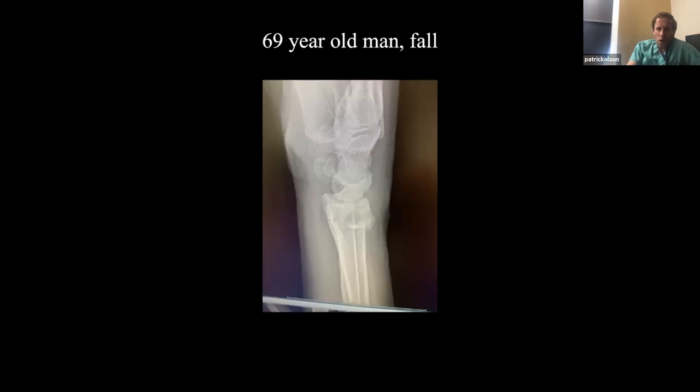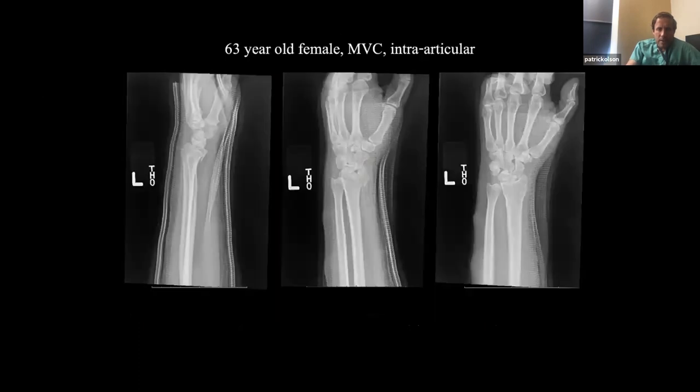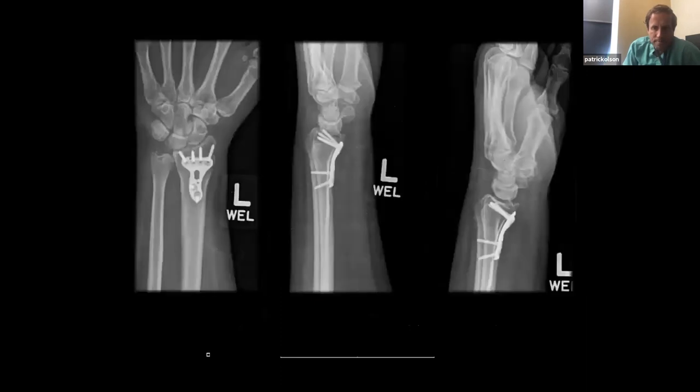Here are a couple of examples. A 69-year-old gentleman had a fall with a dorsally angulated distal radius fracture — this is the post-op. A 63-year-old woman had an intra-articular distal radius fracture — you can see the fragment — this is her post-op. I typically just do two proximal screws. There's a feeling you have to go with three, but you really don't. Two solid proximal screws is all you need for the far majority of these fractures. The oblong hole does have locking ability for a third screw, but sometimes it's right at the fracture and you can't use it.